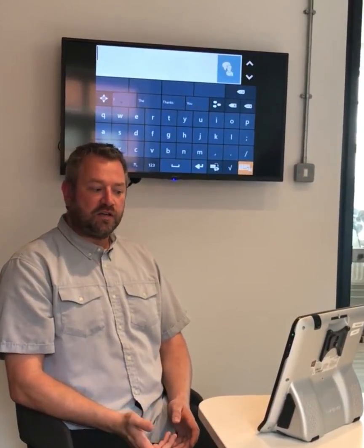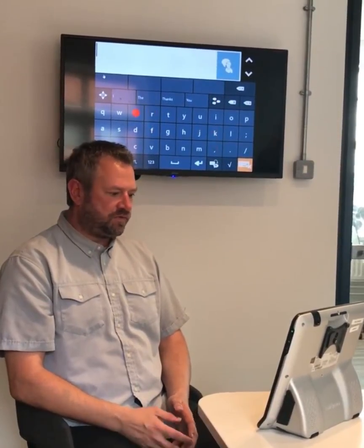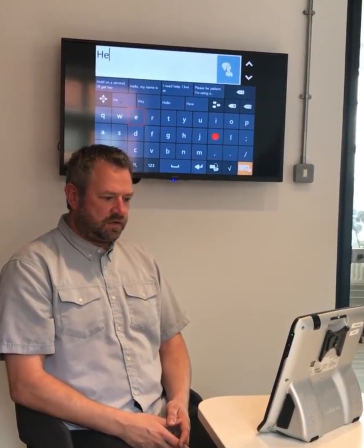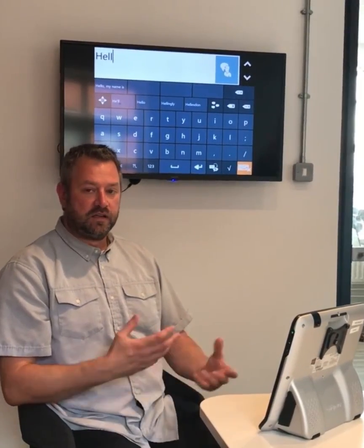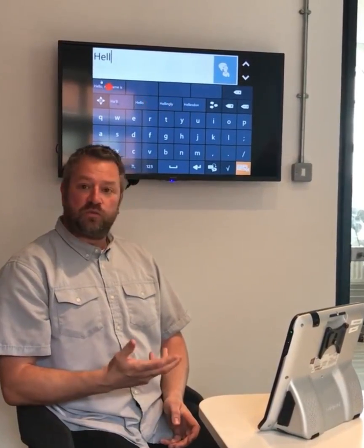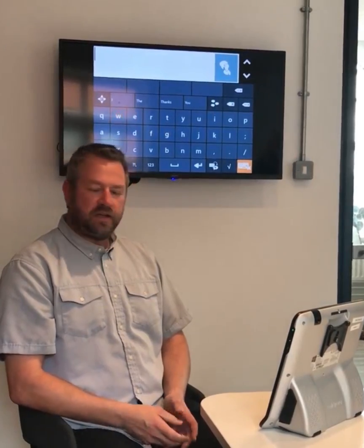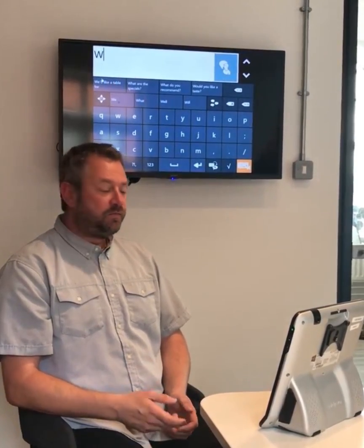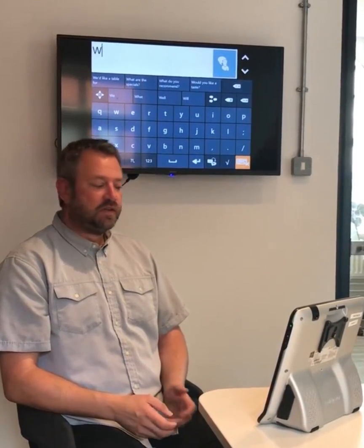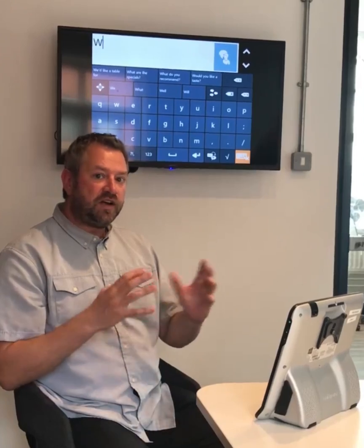So when I come out now, you can see on my keyboard that I'm going super fast. When I'm typing 'hello,' I almost don't need prediction anymore because I'm going so quickly — my word prediction is almost not as quick as me typing. But I still want my phrases. When I'm hitting a W, for example, I get my phrases that start with the letter W. And you can see now that I've got a problem: my dwell time is too fast to allow me to read my phrases, so now my phrases are no use to me.